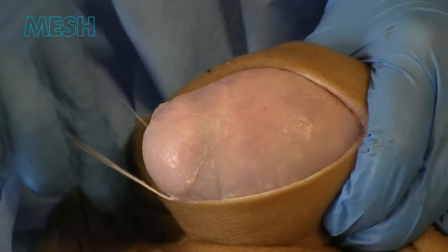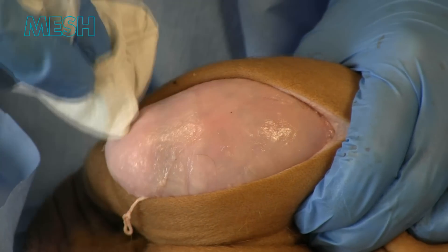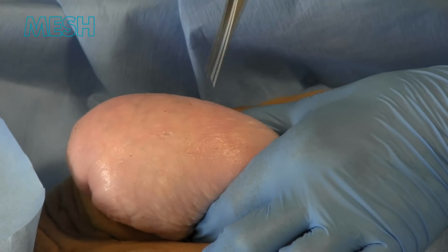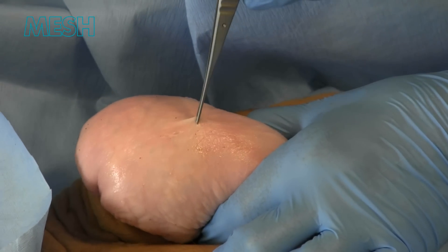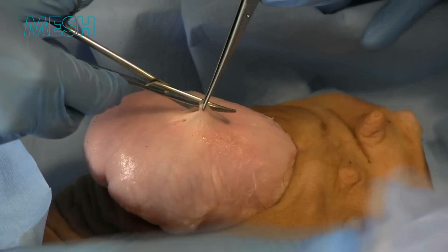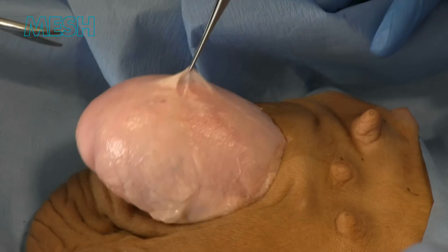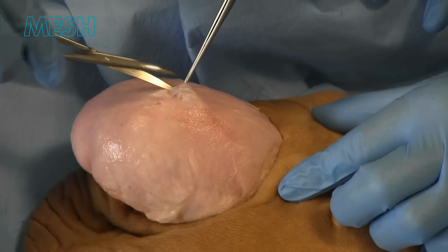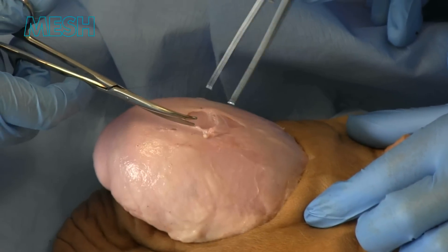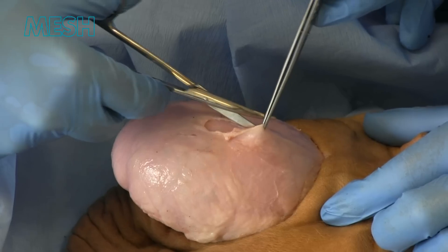The testicle within tunica vaginalis is delivered from the scrotum, with use of a swab to aid with dissection. Following this, tunica vaginalis is lifted with a pair of tooth forceps and scissors used to incise. Sometimes there are a few layers and it takes a couple of incisions to get in the correct plane.